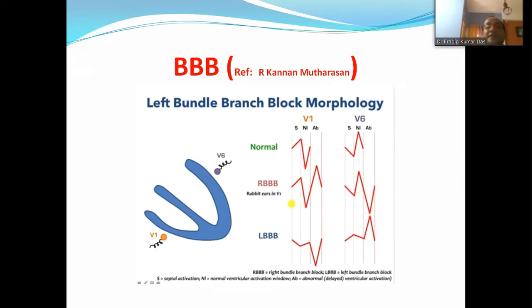Here is the right-sided chest lead, here is the left-sided chest lead. In the right-sided chest lead there will be an upright deflection from left to right septal activation.